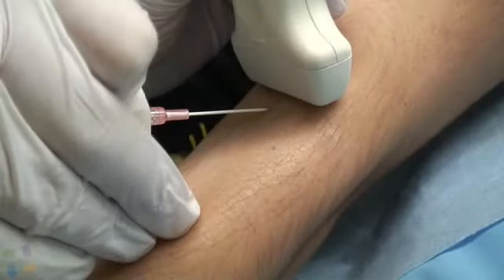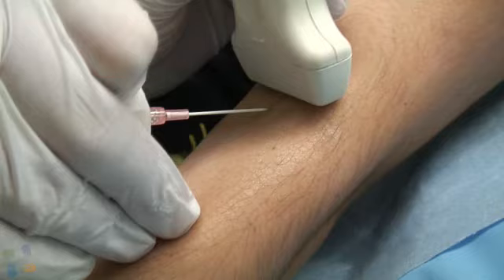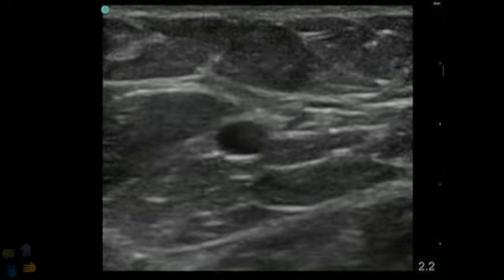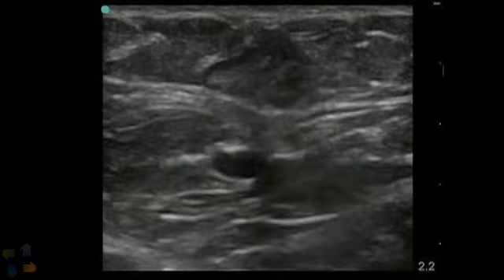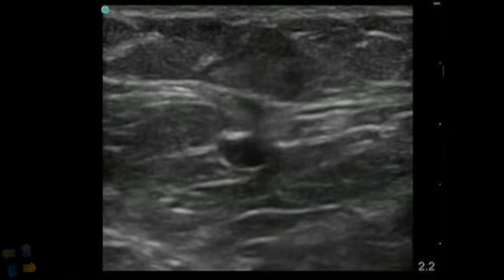With your catheter in your dominant hand and your non-dominant hand on the probe, approach the vessel at a steeper angle than for a normal IV start. An angle of 45 degrees is usually appropriate. It may be helpful to have an assistant position and stabilize the patient's extremity. Watch on the monitor as your needle approaches the vein — you should see the vein walls and surrounding tissue being compressed by the needle. Bouncing the needle gently can help you to locate the tip on the monitor.